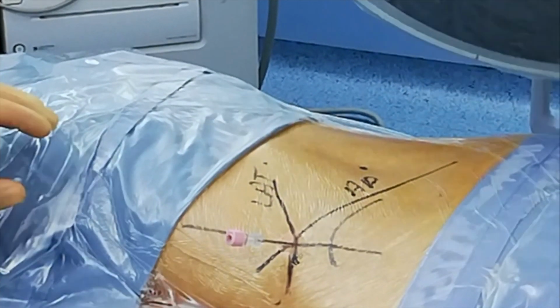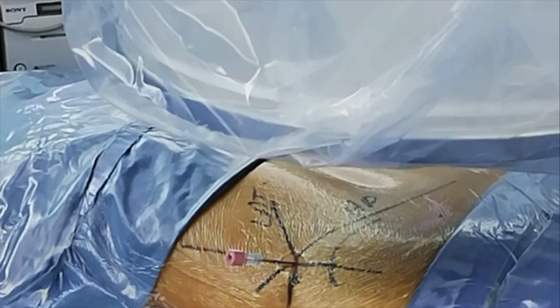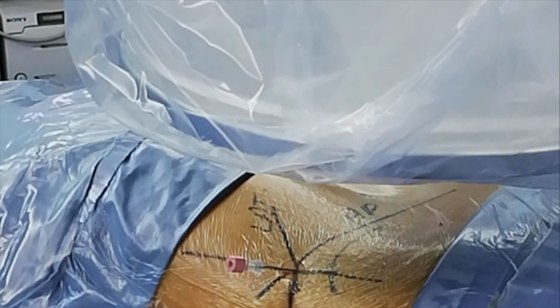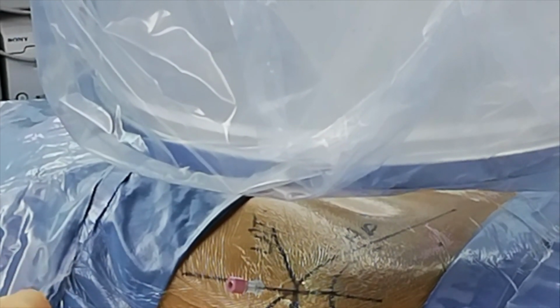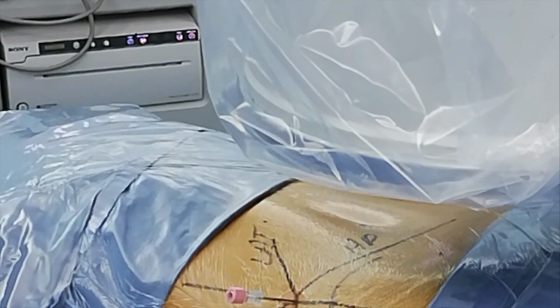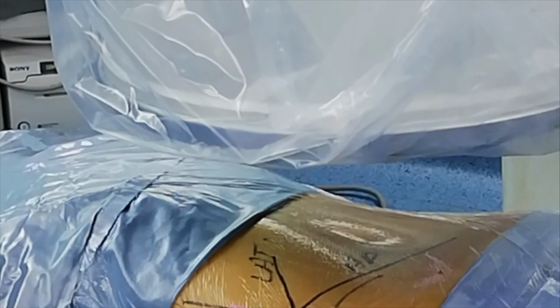So I'm hitting bone, and now we need to check on the AP. Ideally, if you want to go inside the canal, as indeed is the case here, we should be at the medial border of the pedicle of L5. So all the landmarks are related to the caudal vertebra, which is L5 in this example.